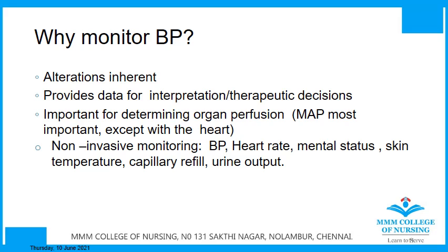Why monitor BP? There are alterations which are inherent. It provides clear data for interpretation and to make very critical therapeutic decisions for the particular patient. So it is very essential for determining organ perfusion, that is MAP. MAP is nothing but mean arterial pressure, which is very important.